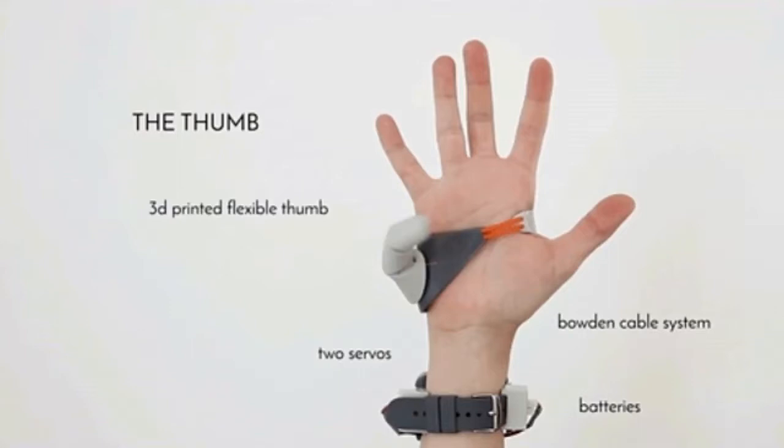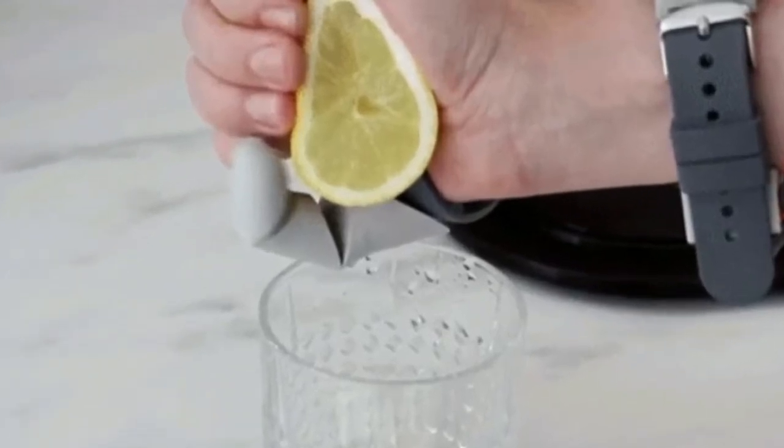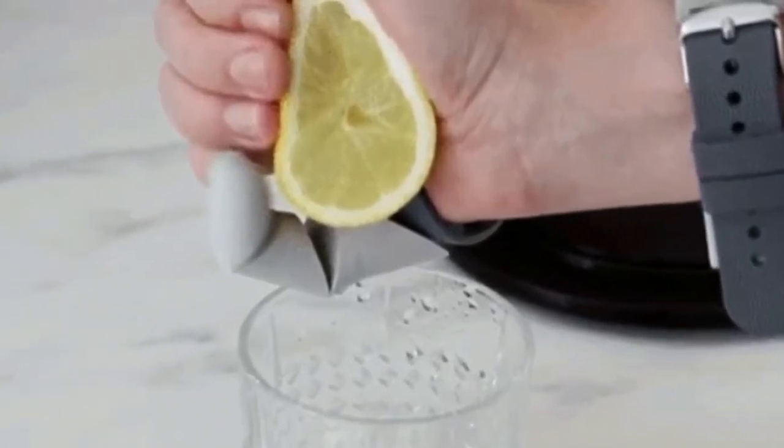The origin of the word prosthesis meant to add, put on to, so not to fix or replace, but to extend. Claude said to Dezeen, the third thumb is inspired by this word origin, exploring human augmentation and aiming to reframe prosthetics as extensions of the body.